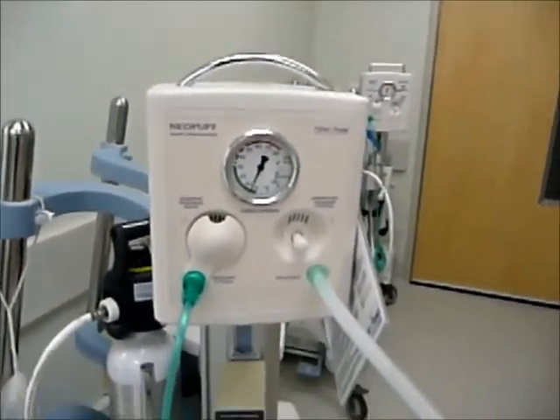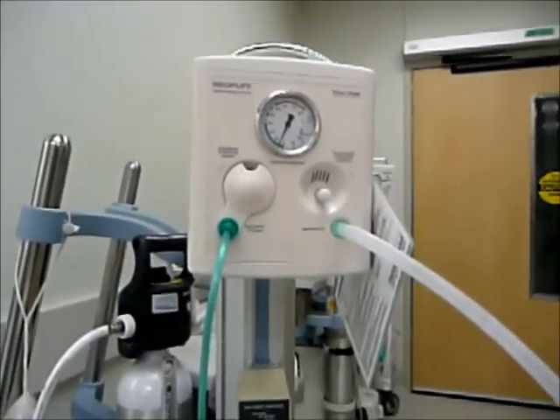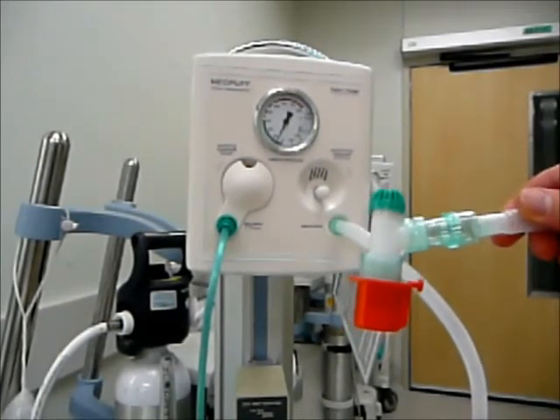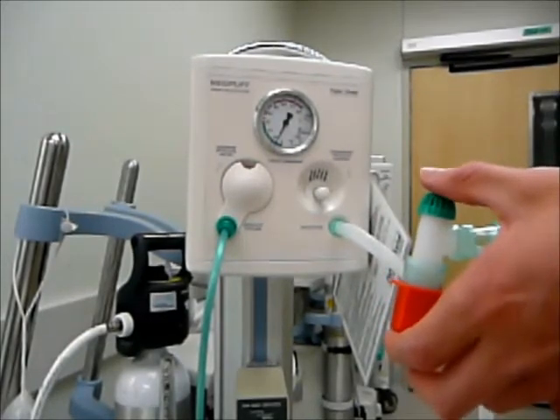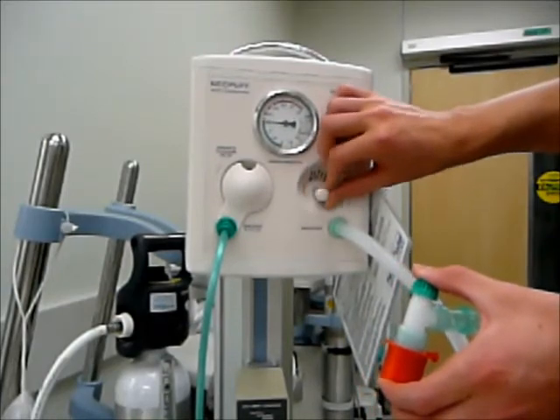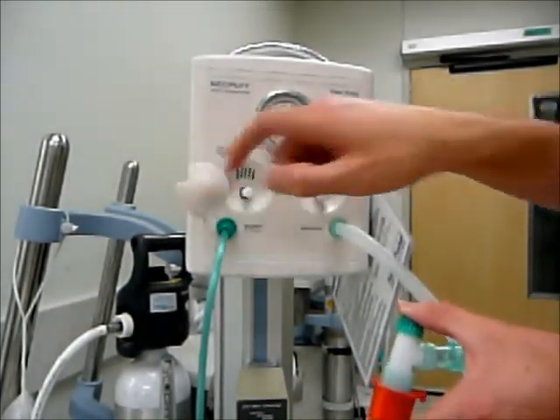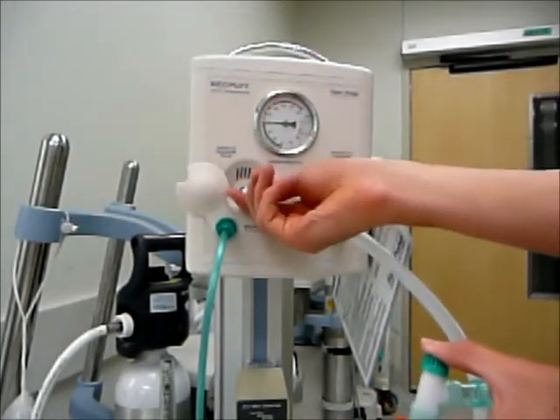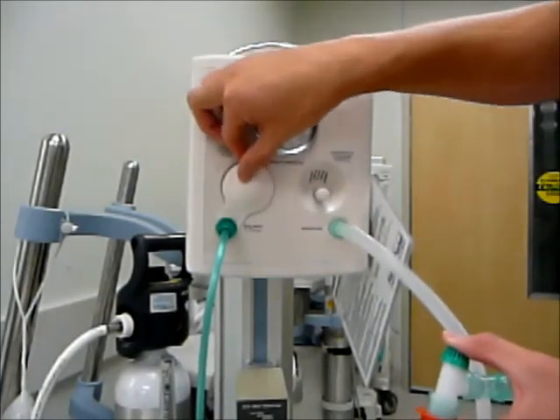Next, what we are going to want to do is set our max pressure relief. In order to set the max pressure relief, we will need to provide a cap or a tester to the end of your circuit, and then just using your finger you can block the top. We are going to first adjust our inspiratory pressure limit so it won't go any higher. Open up our max pressure relief cover and adjust our max pressure relief to 30 centimeters of water. We have set our high pressure relief, so we can close our window.